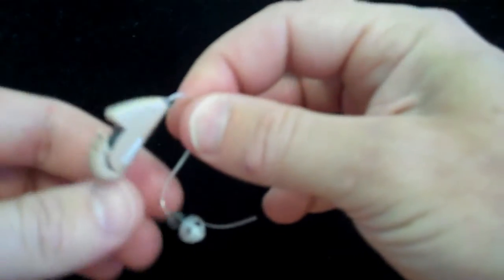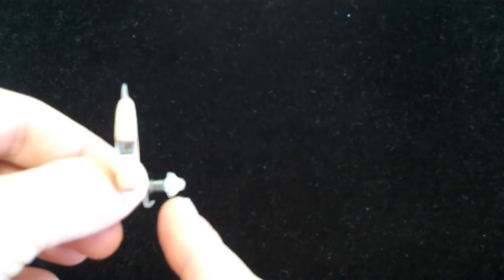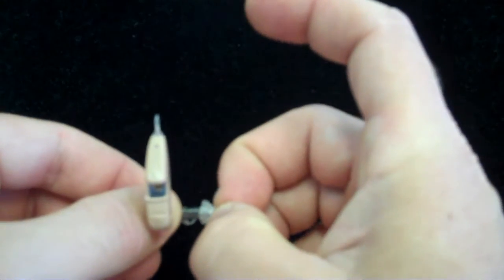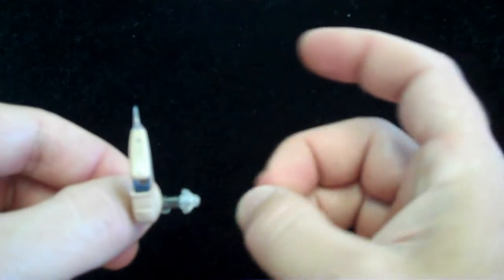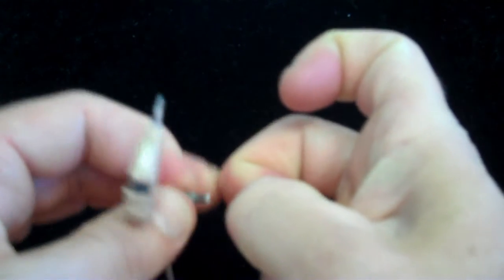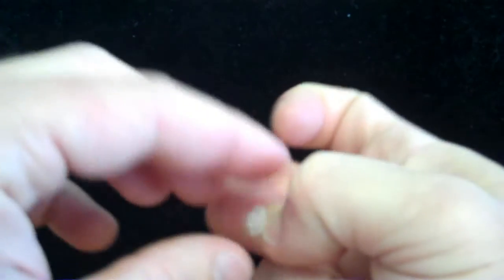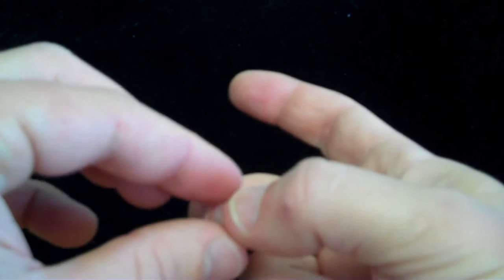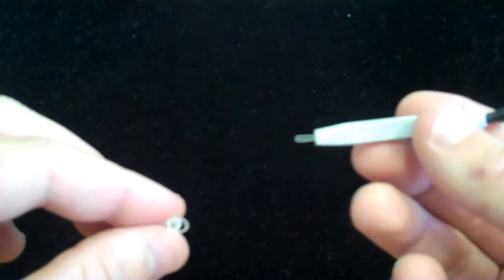Now the wax trap itself is contained at the end of the little receiver here. We actually have two pieces to worry about here, the first of which is this non-custom flexible dome sitting on the end here. That can be removed by pinching the tip of the dome and pulling the dome off. Most of the time in this particular design, wax blocks up the passageway there. The wax is actually trapped inside the dome. The dome can be cleaned very easily.